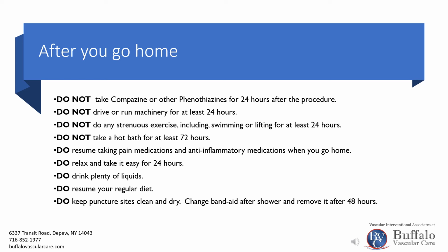Relax and take it easy for 24 hours. Drink plenty of fluids and resume your regular diet. Keep puncture sites clean and dry. Change Band-Aid after shower and remove it after 48 hours.